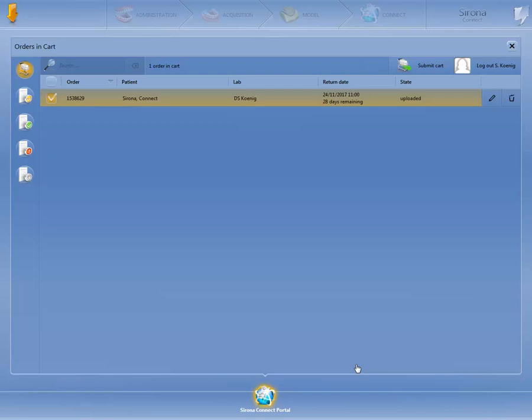The Sirona Connect software directs the customer to the cart. Here, the dentist receives an overview of the orders that have previously been placed. In addition, we can see which orders have been accepted and which have been rejected. A complete overview is provided, regardless of whether the orders have been placed, accepted, or rejected.